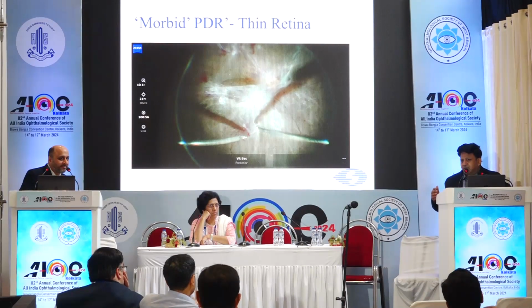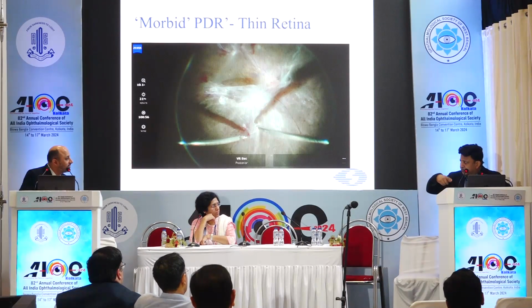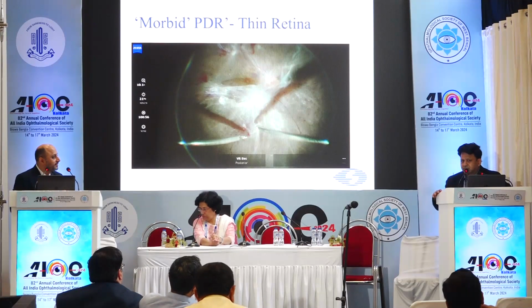In those cases, I generally make a cut from the periphery and go all around, 360 degrees as you showed, and then start dissection.